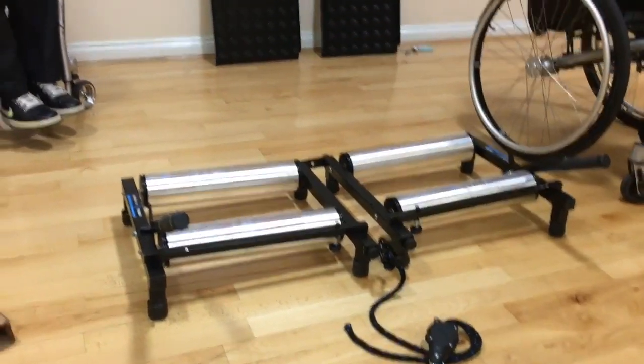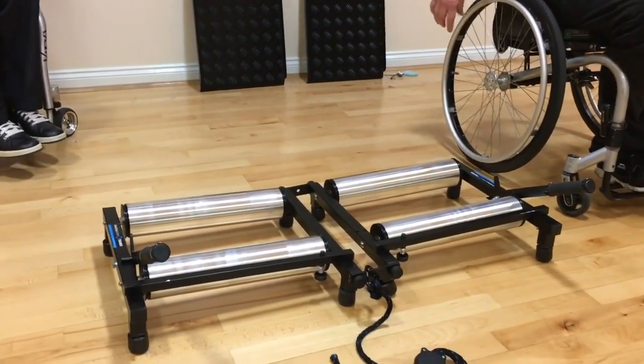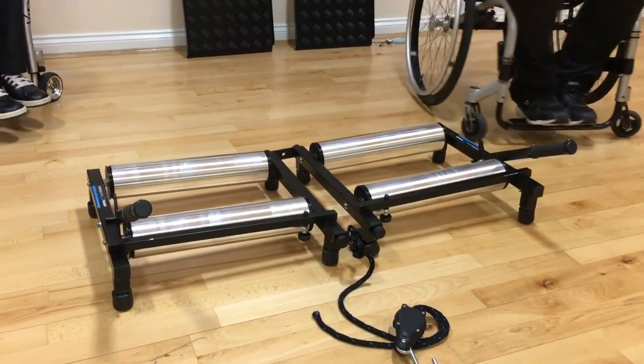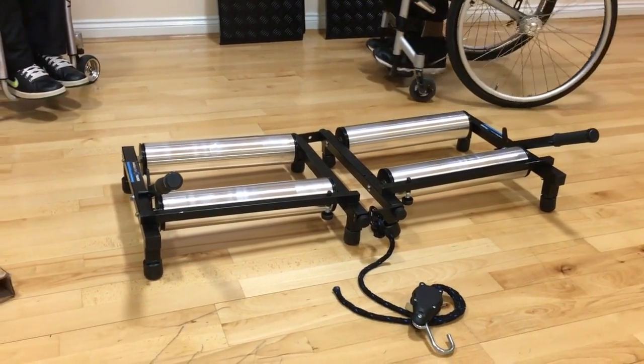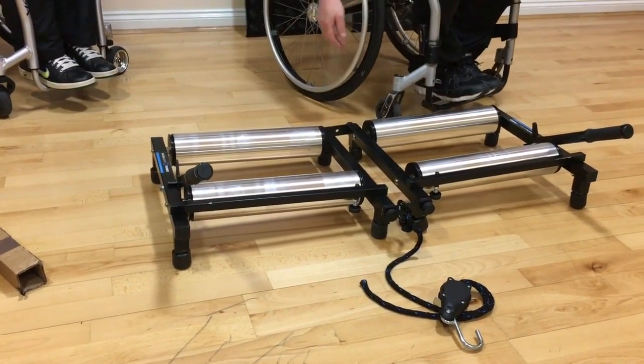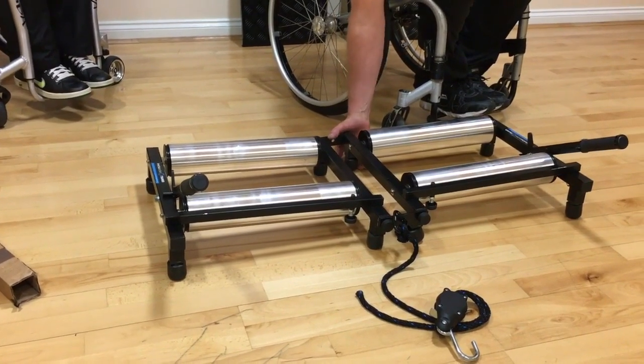The last thing we want to do before putting the ramps on is check that all feet are level and flat on the floor. If you look around the trainer, you'll see that not all feet are touching the floor correctly. So just square the feet up and push the trainer down towards the floor.